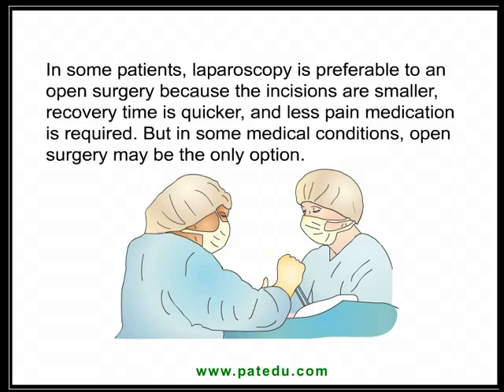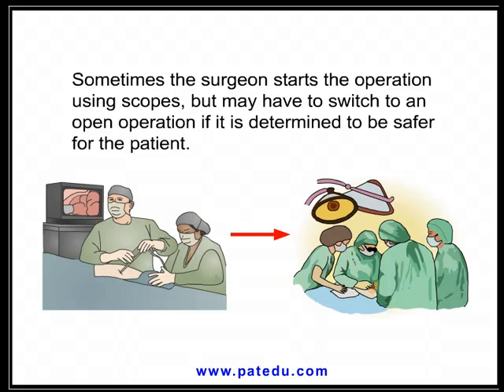In some patients, laparoscopy is preferable to an open surgery because the incisions are smaller, recovery time is quicker, and less pain medication is required. But in some medical conditions, open surgery may be the only option. Sometimes the surgeon starts the operation using scopes, but may have to switch to an open operation if it is determined to be safer for the patient.